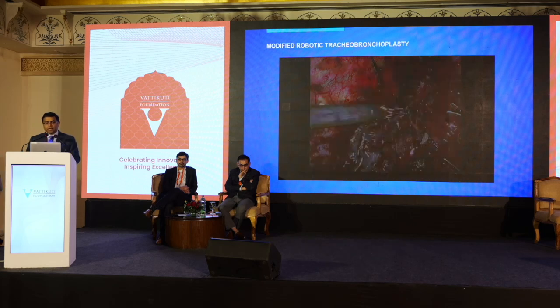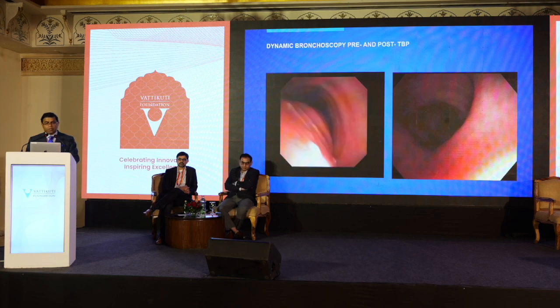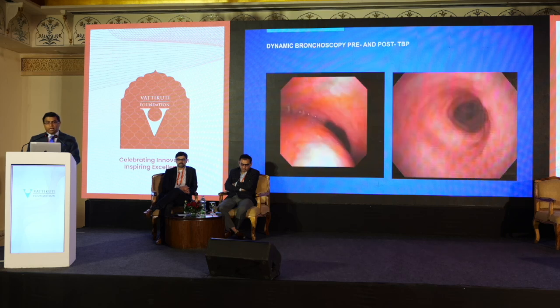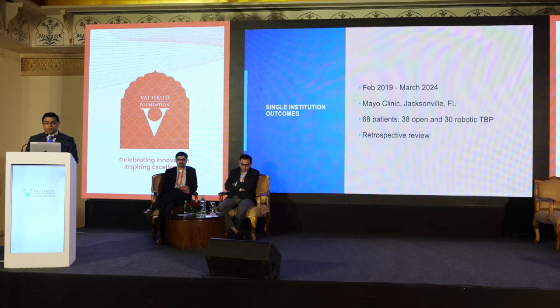And this is the finished product. And if you were to look at the bronchoscopy, the one on the left side of the screen is pre, and here's the post. You can see how wide open it is. You can see the dimpling in the back wall. So, our outcomes very quickly.